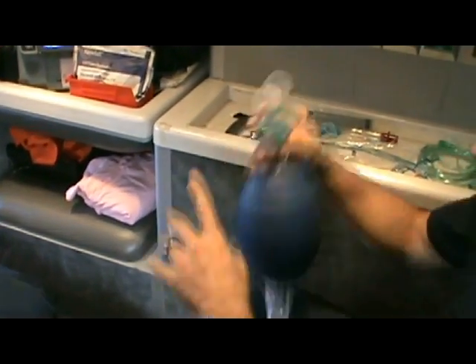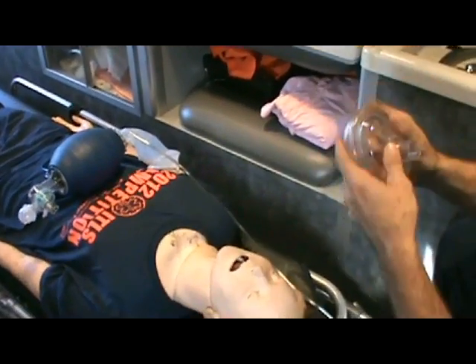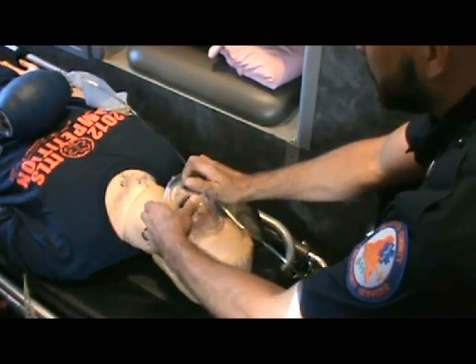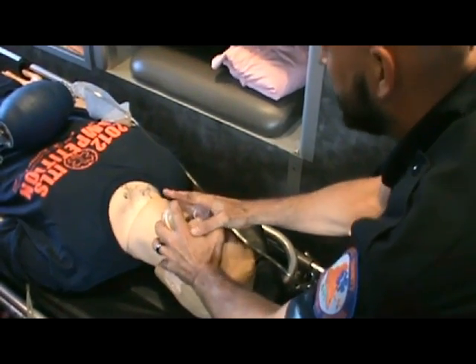What I'd recommend is take it out of the bag, place the bag down and hook it up to oxygen. Take the mask, open it up, place it at the bridge of the nose and wrap it all the way around to where you need it, then go ahead and get a good seal.